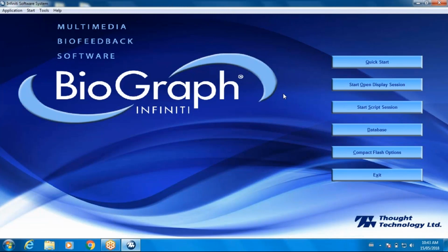We actually have one question coming in from a participant, and they're wondering how many electrode sites the NeuroGuide Z-Score database can look at. That's a really good question. Dr. Thatcher's original recordings actually focused on the 19 major sites of the 10-20 system. Although he's still doing data reanalysis because he has access to that raw information, the database itself focuses on those 19 primary sites, all of which we can look at in the Z-Score suite.